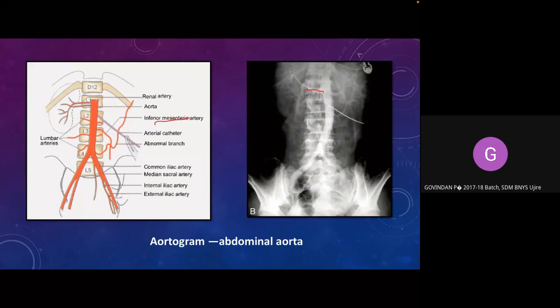When you need to know, you can look for an aneurysm, you can look for a rupture, you can look for opposite-sided aortic arches, that is dextrocardia or dextroversion of the body, as we call it. You can see that through these images.